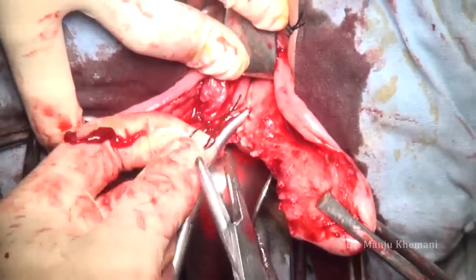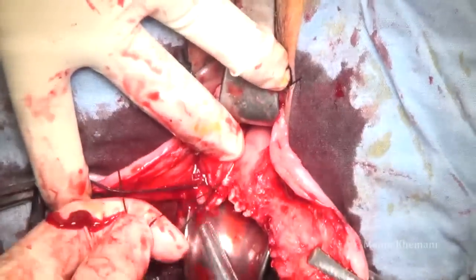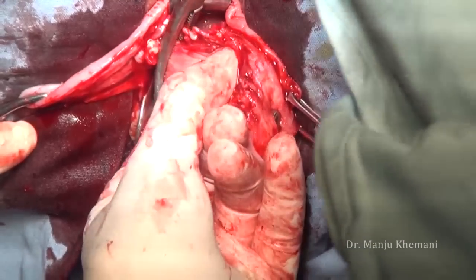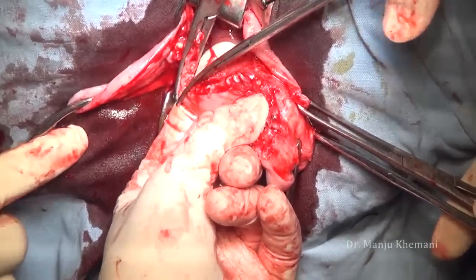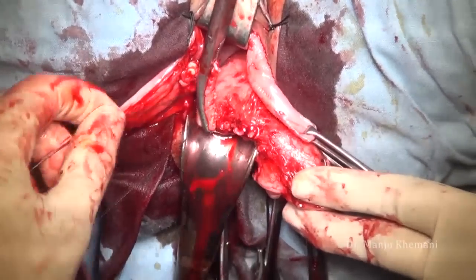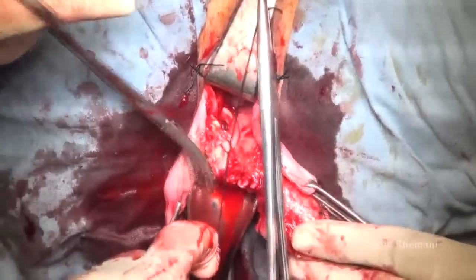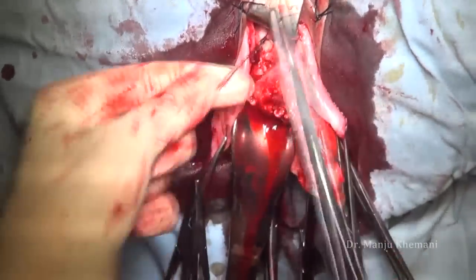Once I have ligated the uterine artery pedicle, we cut it. The uterus is delivered posteriorly and now I am on the upper pedicles: ovarian tube and round ligament. Usually I use two clamps, but here the pedicle was small so I'm using one clamp. Transfix properly because the ovarian vessel comes from the aorta, so I always take a second ligature to ligate this pedicle once again — in case the ovarian vessel slips and bleeds, a hematoma may reach up to the kidney.